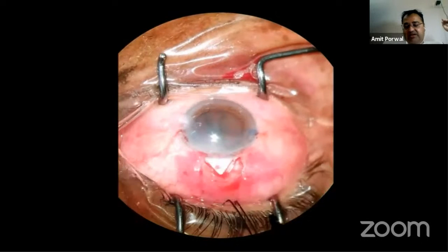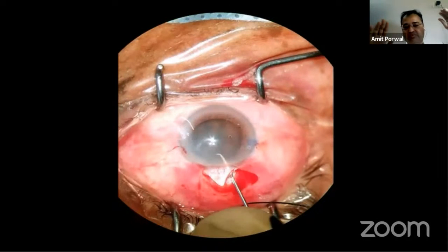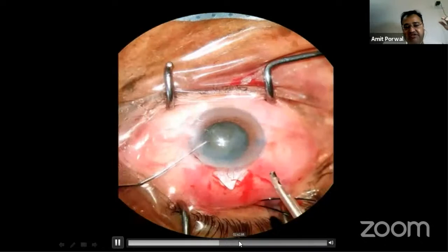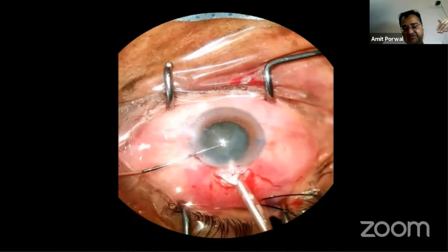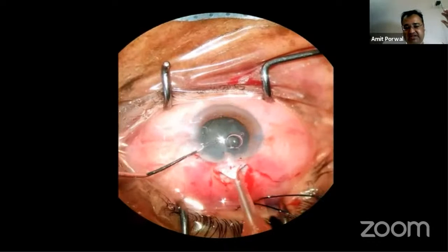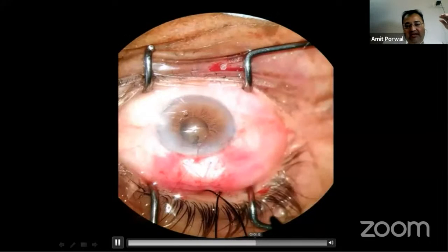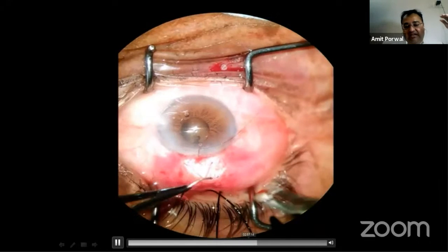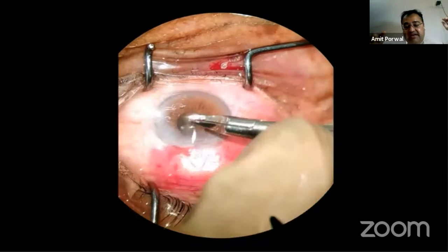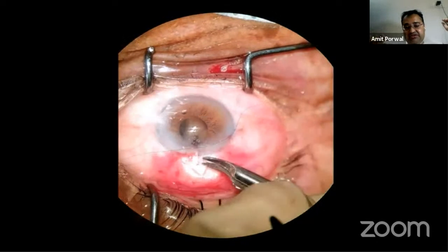And now once you have entered this, you are going to do the phacoemulsification on the same superior side. So all your steps remain the same. All the precautions of phacoemulsification which I had discussed in my previous video are followed. So only thing is, earlier it was said that the success rate of a single site is less than the twin site because of the thermal energy which is released at the phaco probe that causes failure of the bleb.